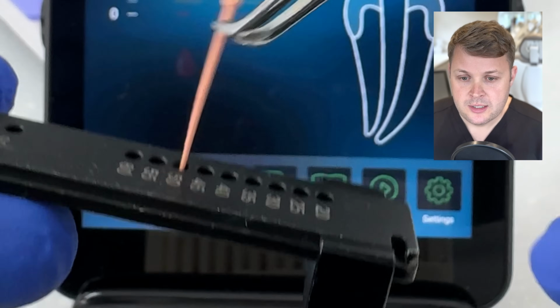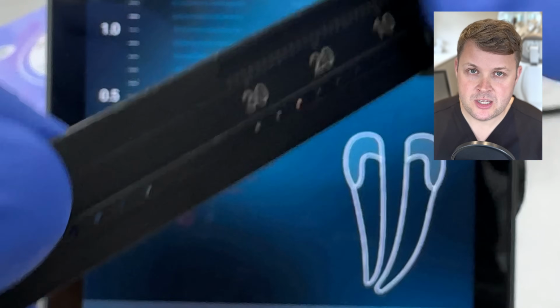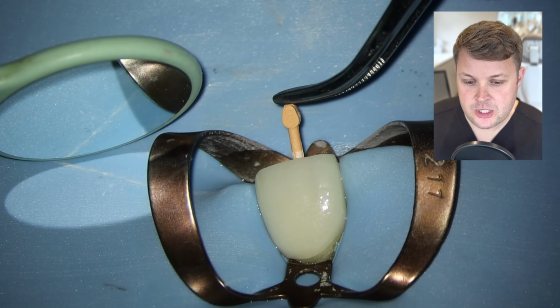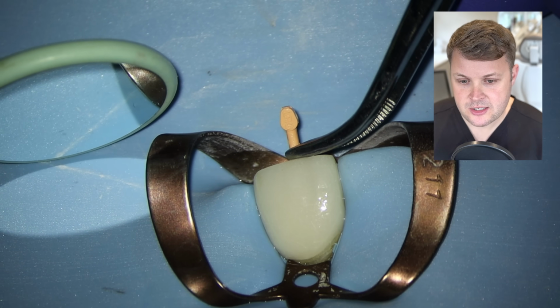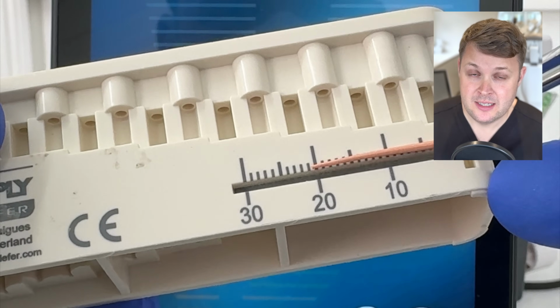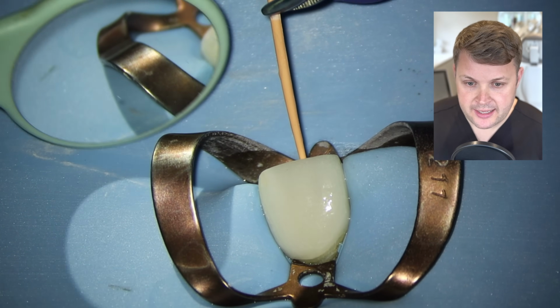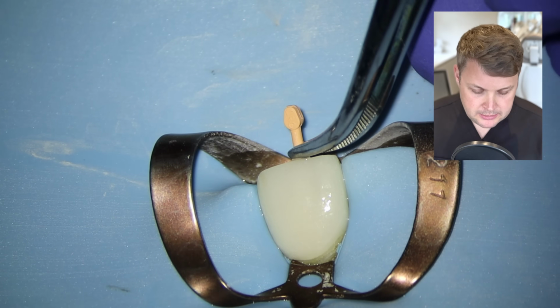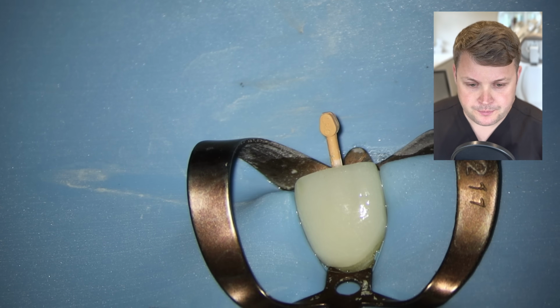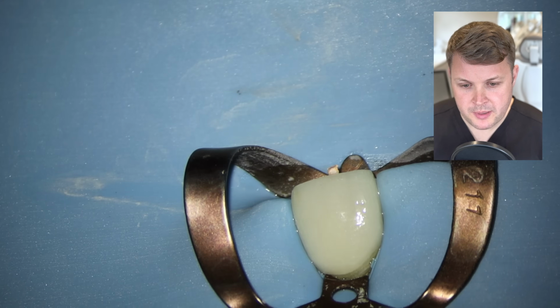Essentially what we do is we just snip off the GP cone at 50. So we used a specialized GP cutter here. So we've gone from 45 to 50. And as we push this GP cone to length, it fits nice and snugly at the working length, which is 21.5 millimeters, this is minus 0.5 millimeters away from the zero reading. And then we place the GP cone to length, we can kind of feel that lovely tug back. Here now we've got a nice bit of tug back on that. It looks really, really nice.